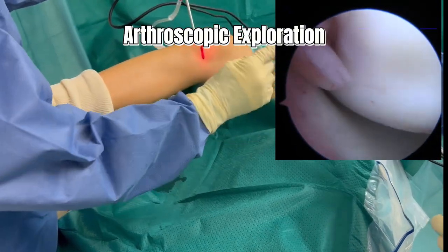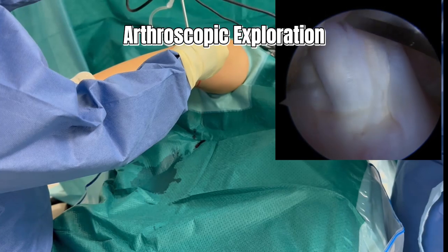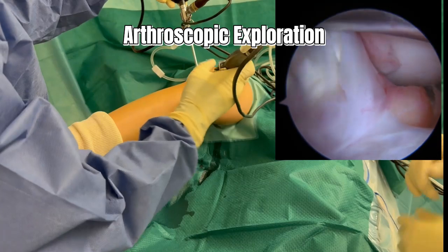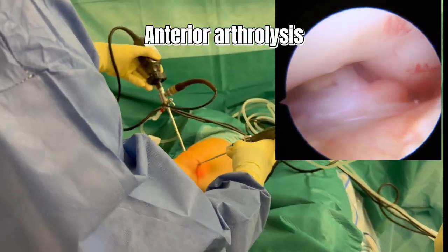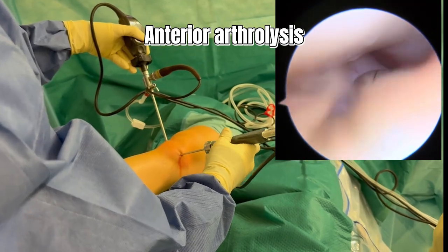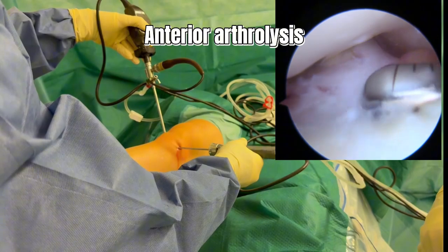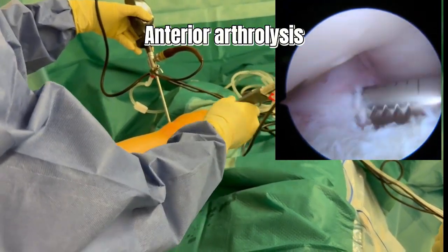The intercondylar notch area is closely inspected for cyclops lesions or any anterior fibrotic tissue that may impede full knee extension. Dynamic assessment involves passive flexion and extension of the knee. Using a motorized shaver, all cyclops tissue and impinging soft tissues are removed carefully to help achieve full extension of the knee.